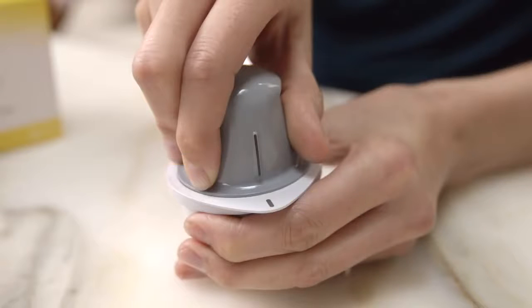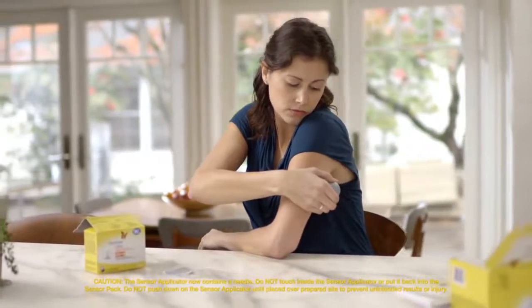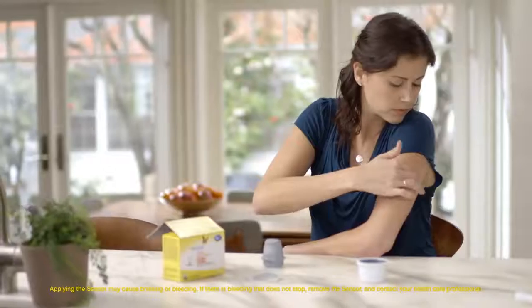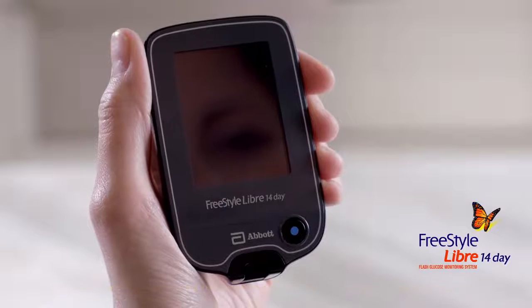Lift the sensor applicator out of the sensor pack. Simply place the sensor applicator over the site you cleaned with the alcohol wipe. Push down firmly until the sensor is in place. Make sure the sensor is secure after application. All that's left is to start the sensor.